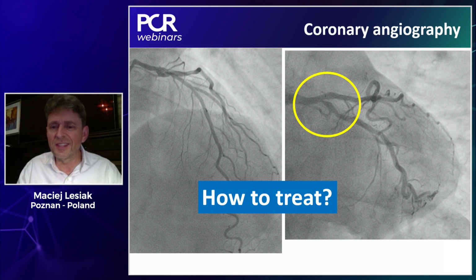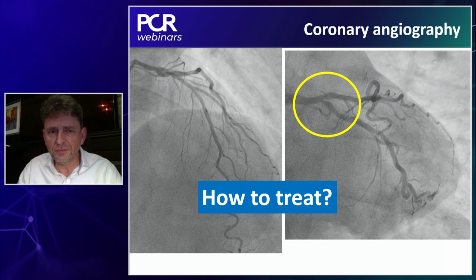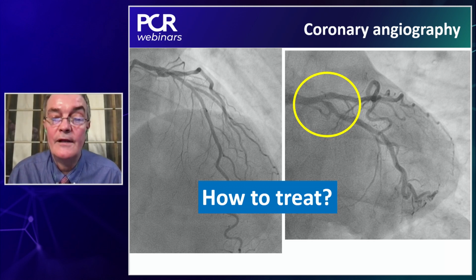As for the nitrates, that's the first thing that occurred to my mind. It's really important, if the patient tolerates it, to add nitrates, sometimes twice or even more, especially for ostial left main. I remember a couple of cases where after 3 or 4 doses of nitrates the vessel grew. This of course looks atherosclerotic, so it definitely needs treatment. So protecting the LAD, pre-dilatation, and then depending on the result of pre-dilatation, perhaps just one stent from the left main to the circumflex.